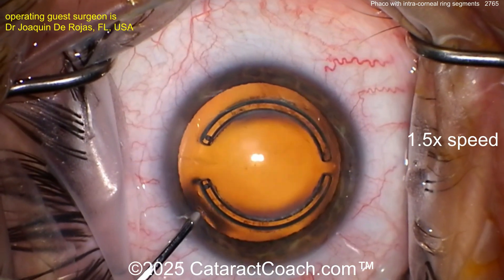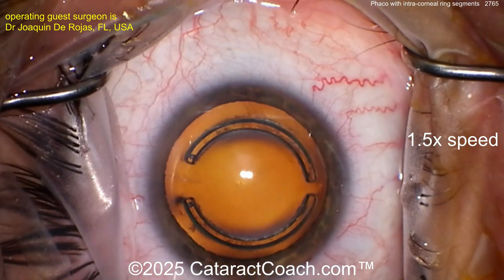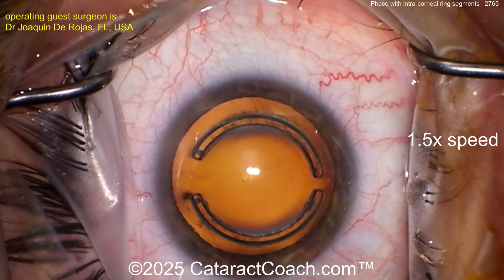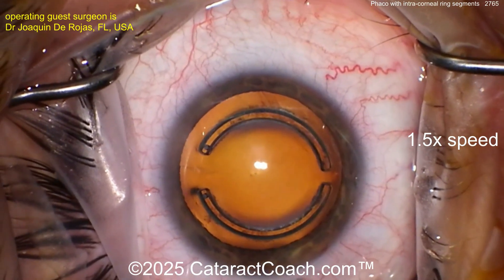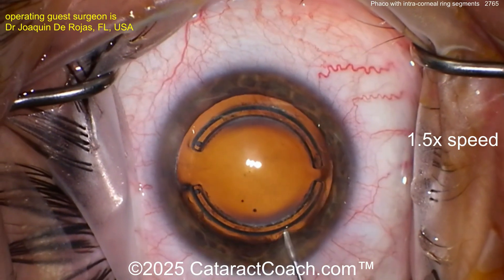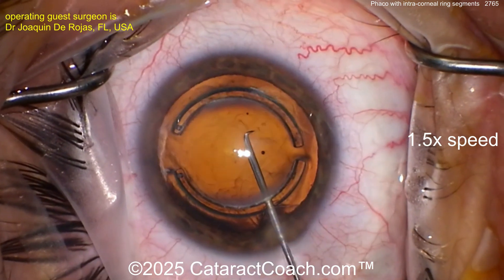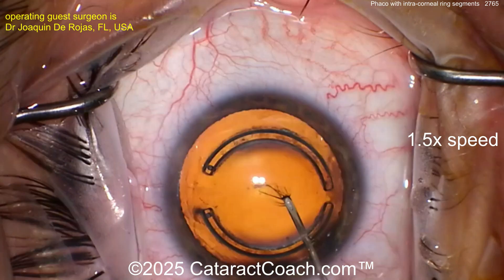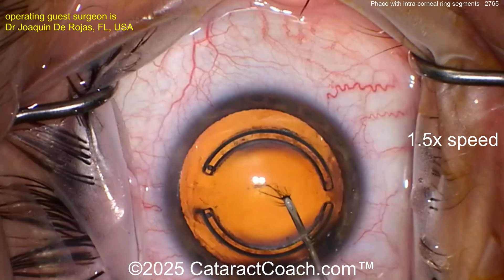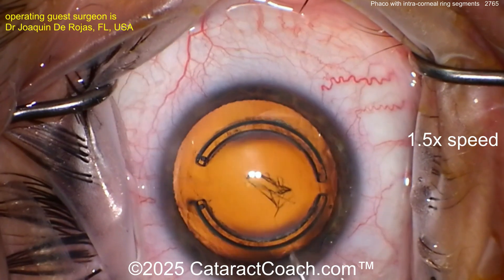Dr. de Rojas was on our Cataract Coach podcast, where we talked about how you can succeed by working in a private equity practice. It's not for everyone, but if you're considering that path, listen to that podcast. Now we're going in with a visco combination — viscoelastic plus the cystotome — getting that cystotome poked into the anterior lens capsule.